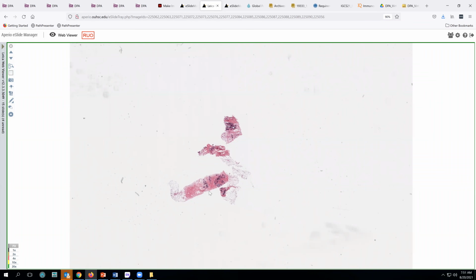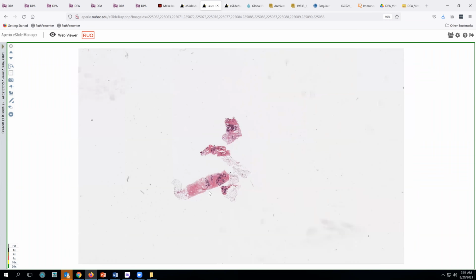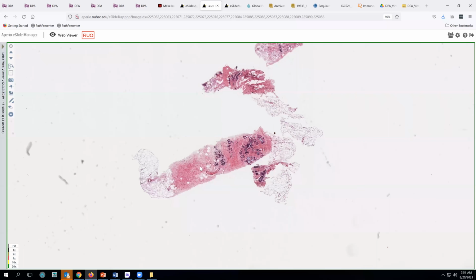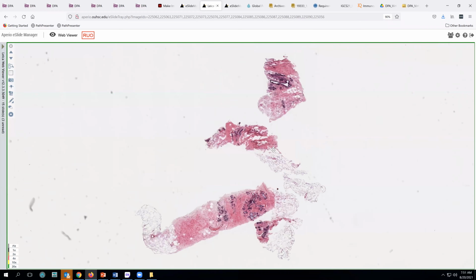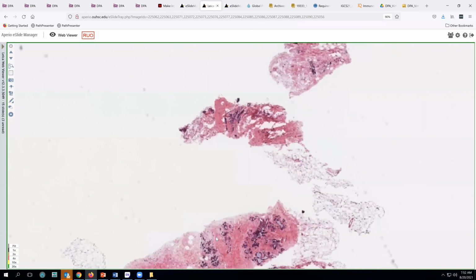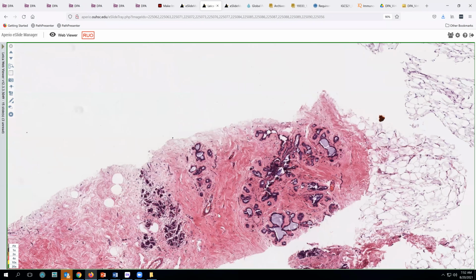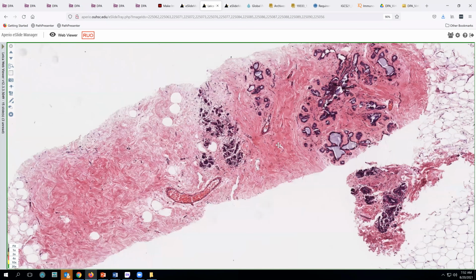And so here we see a few small cores. And this, I think, underscores the importance of radiographic and pathologic correlation. So typically, when we sign out breast cases, the radiologist who did the exam and did the biopsy will get a report of what we see.